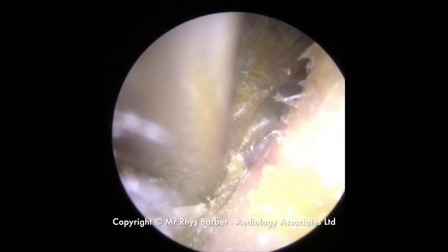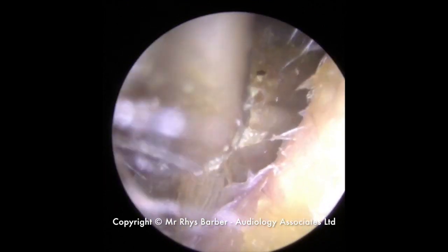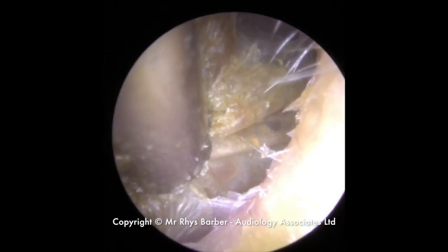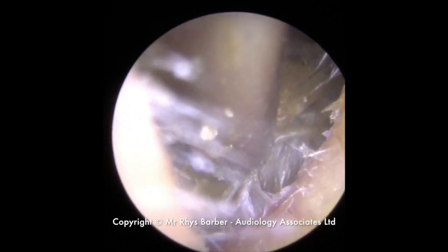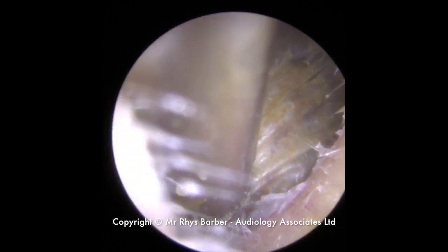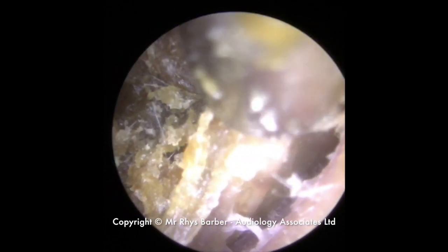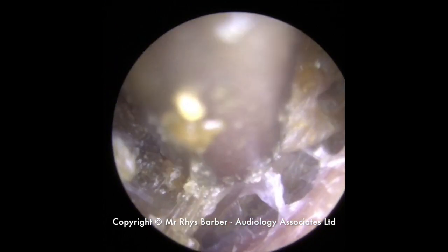You can see there's actually a ring of it that goes right the way around the ear canal. So as we're starting to pull on the bottom section here, you can just see more skin lifting there. So lots of this dead and hard skin in the ear canal, but it's making it very difficult to get a grip on the wax that's sitting behind it. And I can't get this wax out until this skin is removed.